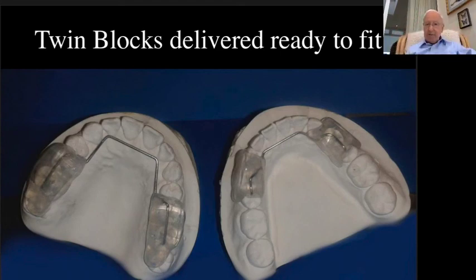The appliances may be removable or fixed, and they are patient-friendly. They do not cover the palate, and they're also invisible. They may be combined with fixed appliances on the anterior teeth, and a utility arch may be fitted in the lower arch to control the lower labial segment.